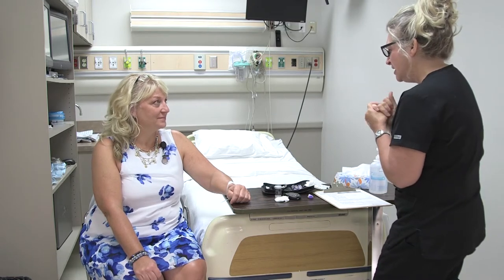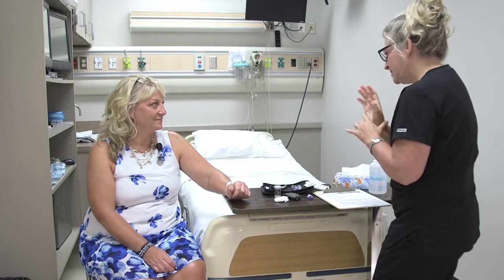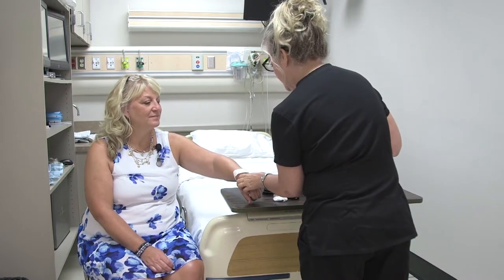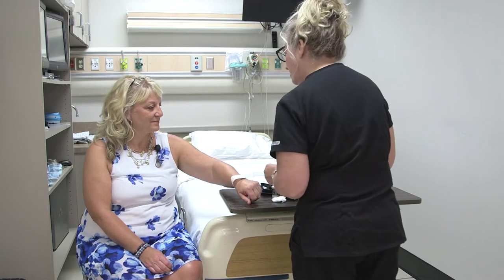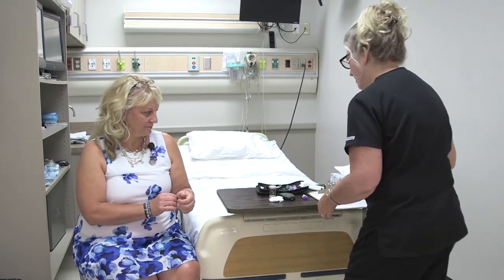I'm going to be taking your blood sugar today. May I first check your ID band? Can you give me your full name and date of birth? Sylvia Vasquez, 1-30-1966. Okay, very good. And just to double check, do you have any allergies? No allergies. Okay, very good.